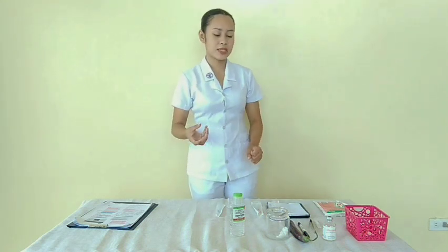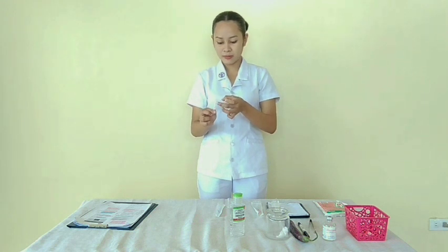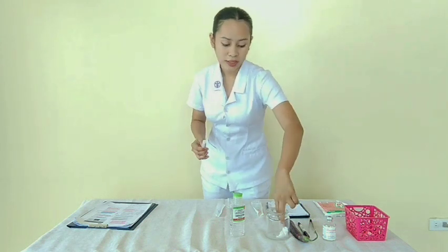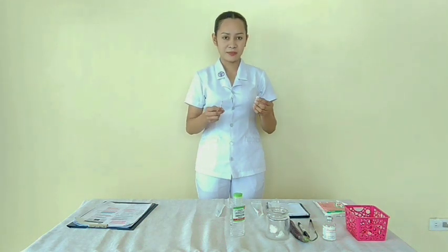And now take the ampule and flick the upper part of the ampule several times. And now place a piece of cotton ball soaked in alcohol, 70% alcohol, between your thumb and forefinger and wipe the ampule neck.